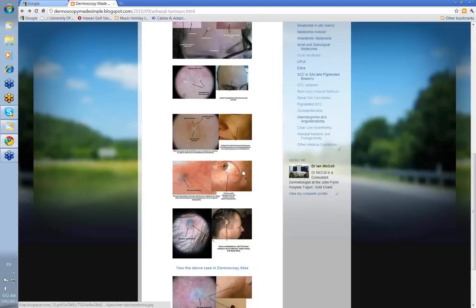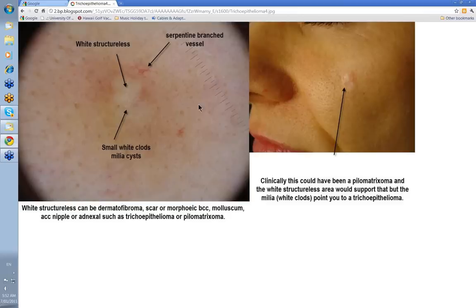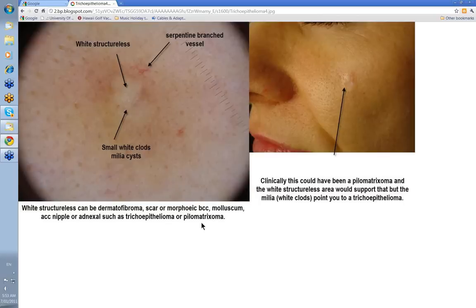We've dealt with white structureless. Let's look at blue structureless. Going back briefly: white structureless can be a dermatofibroma, a scar, or a morphoeic BCC. Remember the dermatofibroma — the white structureless is in the middle, usually surrounded by lines reticular around the outside, due to collagen. The scar and morphoeic BCC also have a lot of collagen. Molluscum will give you white structureless — these are the molluscum bodies. An accessory nipple can sometimes give a white structureless centre. And we've talked about adnexal tumours — the trichoepithelioma and the pilomatrixoma — so these are the things that can cause white structureless.